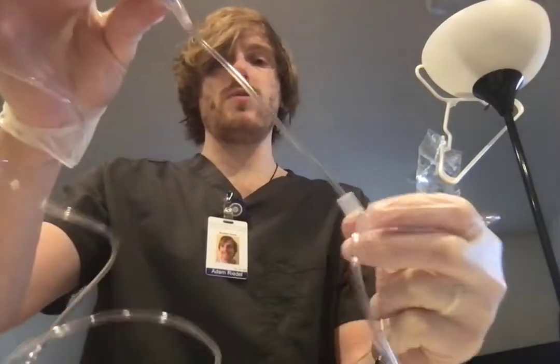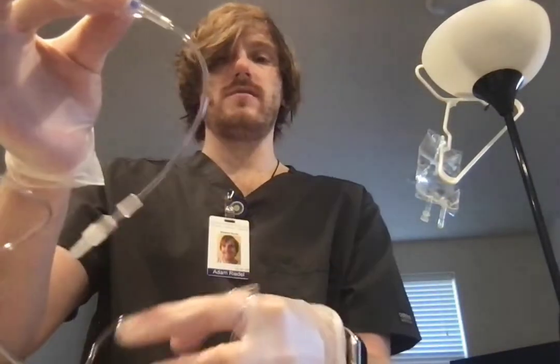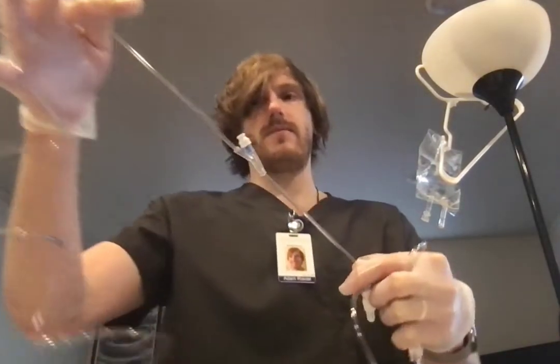It's really close to this adapter, and so it's going to be kind of a bummer to try to piggyback this. I'm not a big fan of how close this is together. I would typically like to see it a little bit farther, so at least I'd have some slack. But anyway, I'll show what I mean in a second.